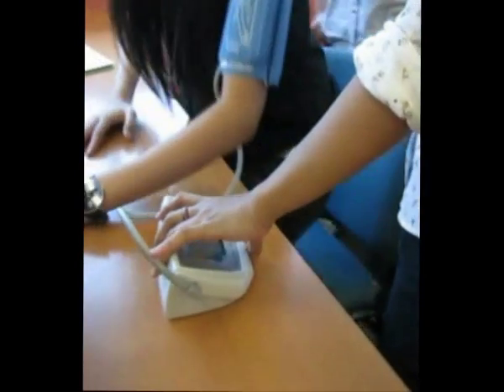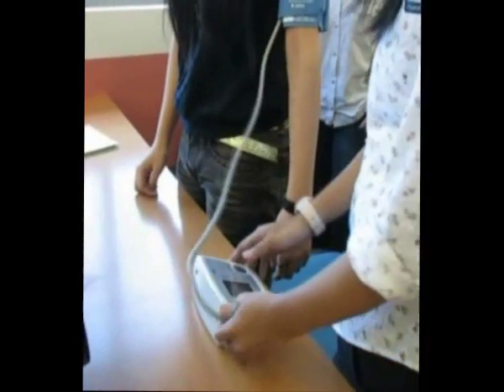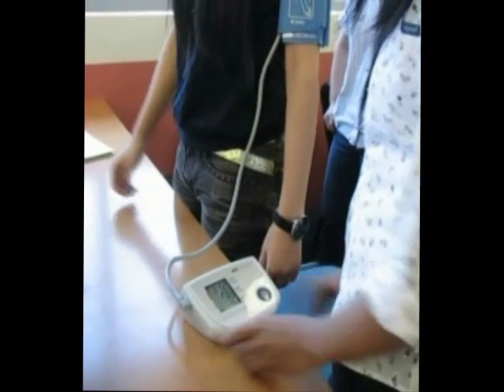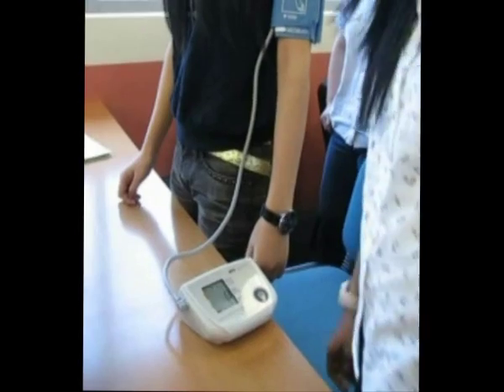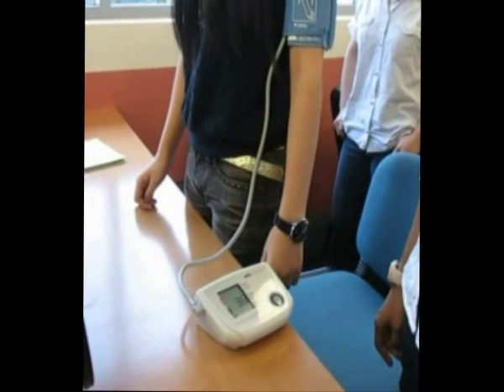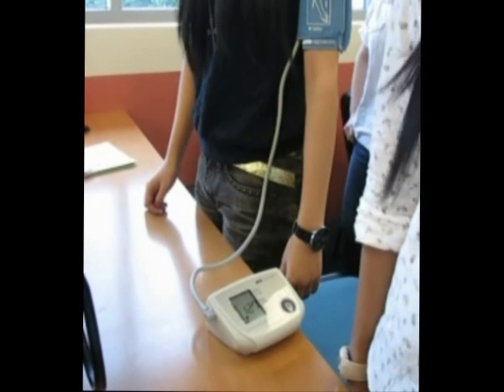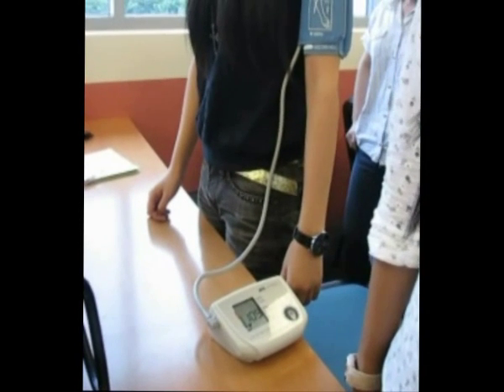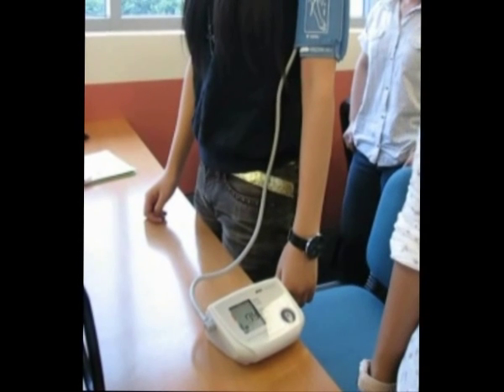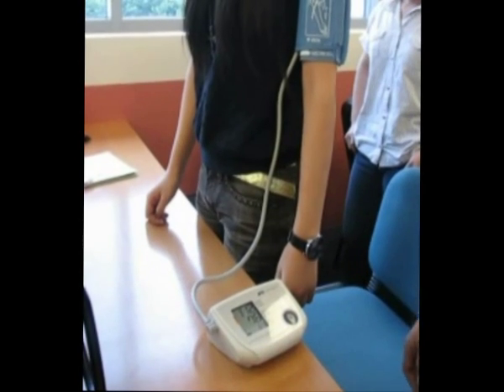Now moving on to standing blood pressure. The sample stands up and has to wait while the machine calculates her blood pressure. The results will be generated soon. The results are 112 over 76.